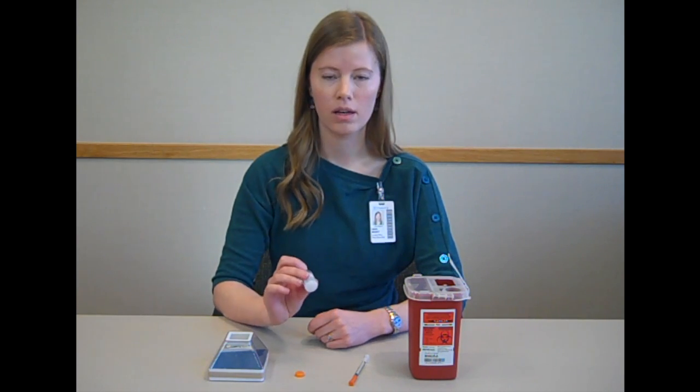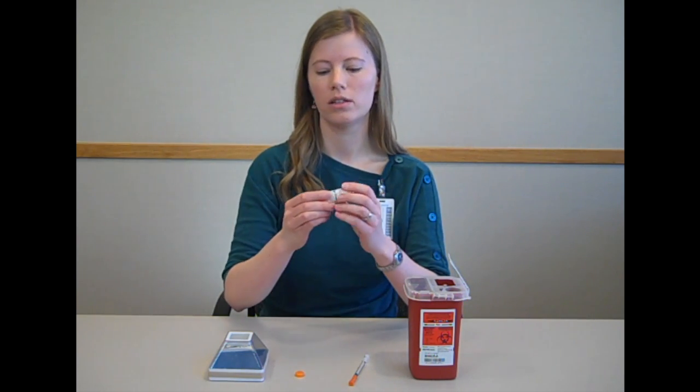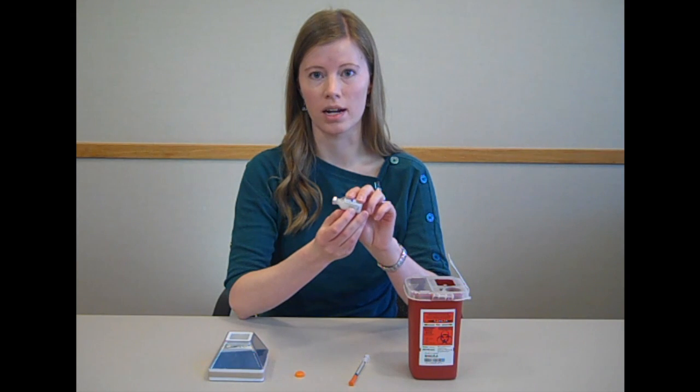Hi, my name is Heidi and I'm a pharmacist. Today we'll be talking about how to inject cloudy insulin. Before injecting your insulin, check the expiration date to make sure it's not expired.